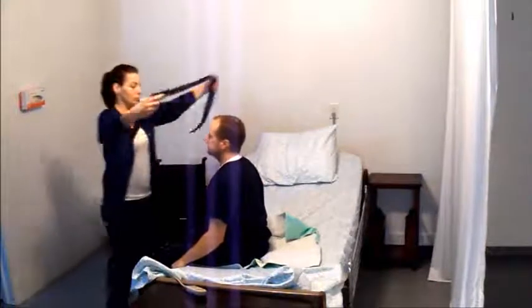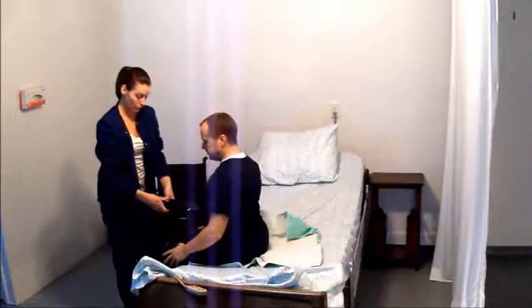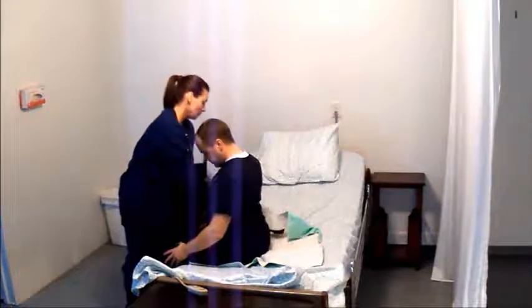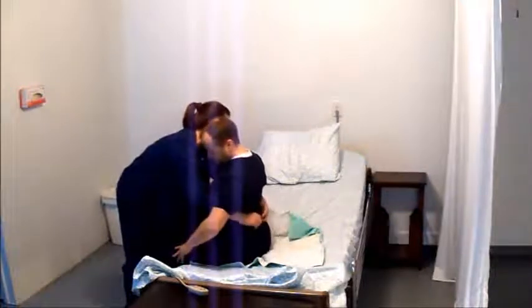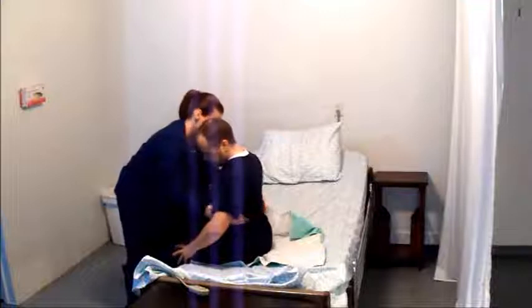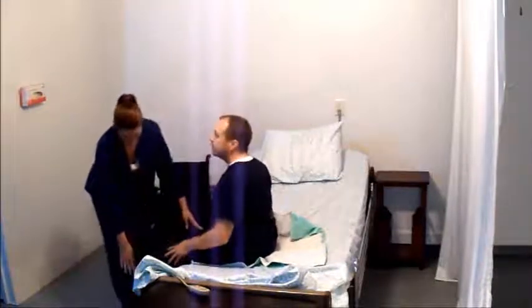Maintain proper body mechanics when assisting the resident to stand, turn, and sit. Transfer the resident as a pivot completed without having the resident take steps to reach the wheelchair, and before assisting the resident to sit in the wheelchair, position with the back of the resident's legs against the seat of the wheelchair.